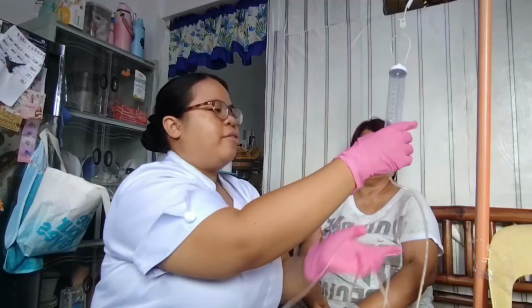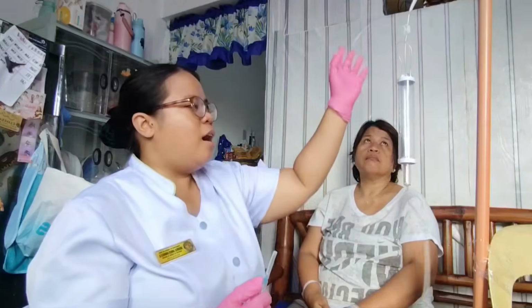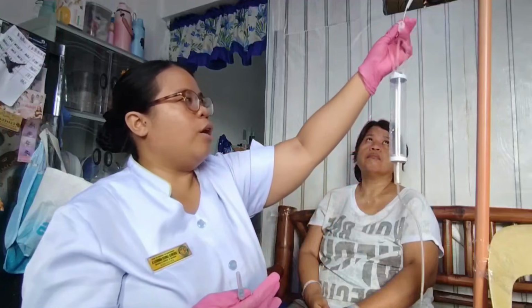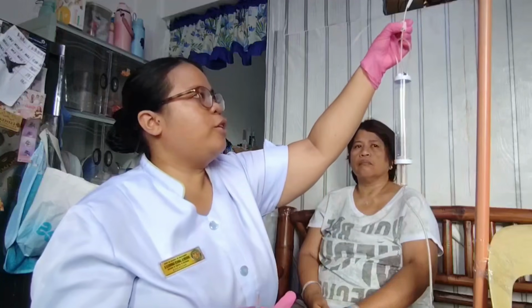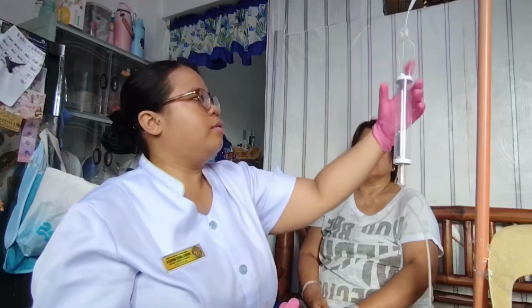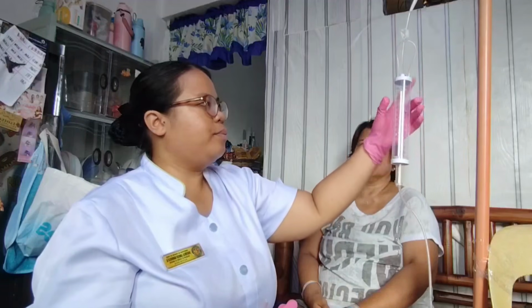Okay, so after hanging we're going to fill the volumetric chamber with the prescribed diluent. So since we're going to prime this first, we're going to put at least 35 cc, or you can do more. So make sure to unclamp this first.